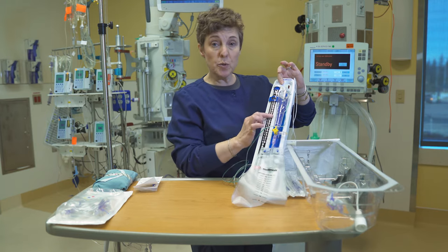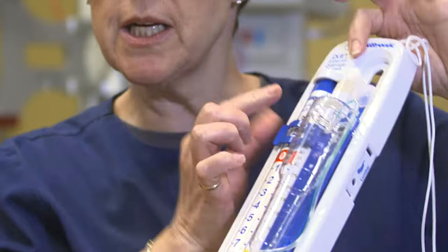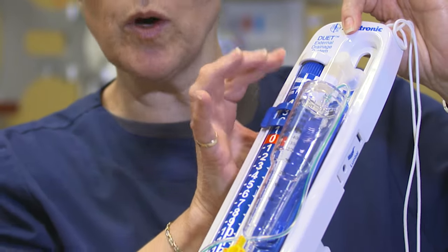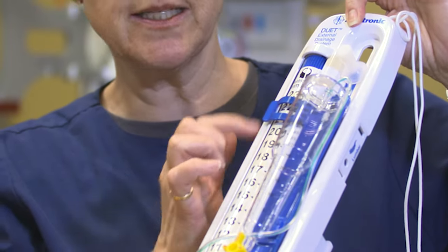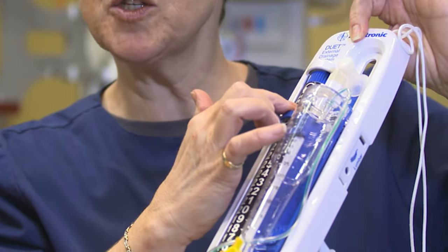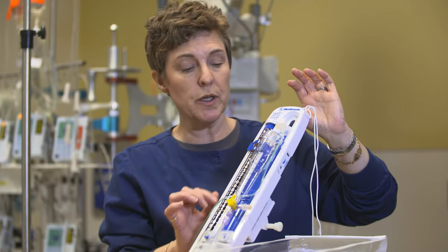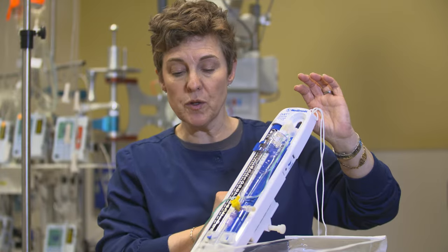This particular system has four areas on it: lumbar in millimeters of mercury, lumbar in centimeters of water, ventricular in millimeters of mercury, and ventricular in centimeters of water. Centimeters of water is the most common method of measurement used for intracranial pressure monitoring, so we'll leave it at ventricular in centimeters of water.